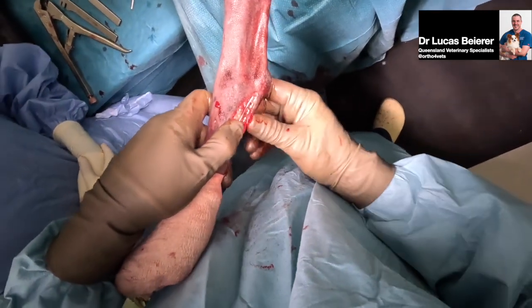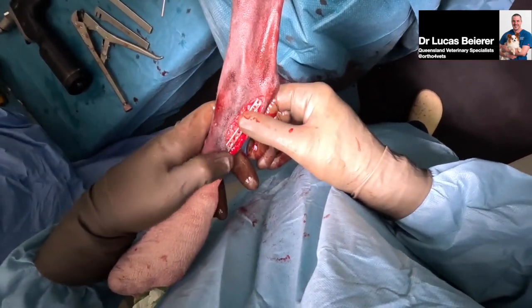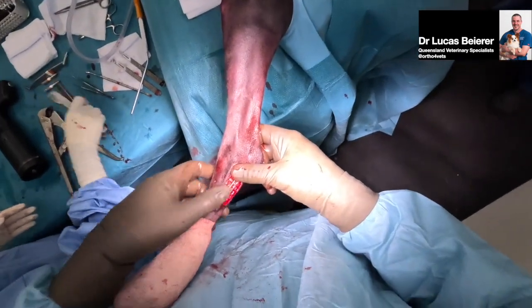So I think that contouring is kind of reasonable, and if we test the soft tissues, I think we can get them closed. One of the things that I've learnt is not to do an incision too distal, because then it gets harder and harder to close. So we can move that a little bit if we need to.